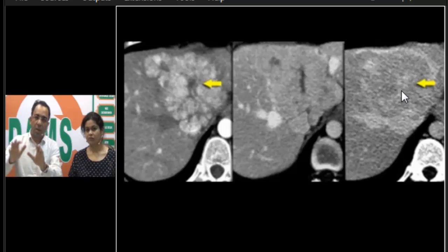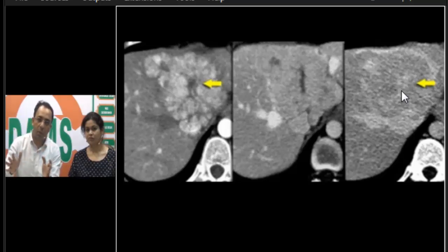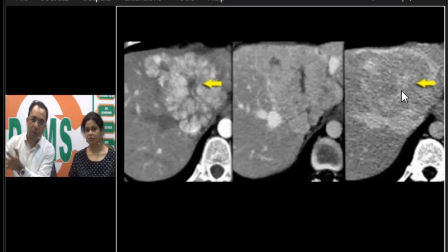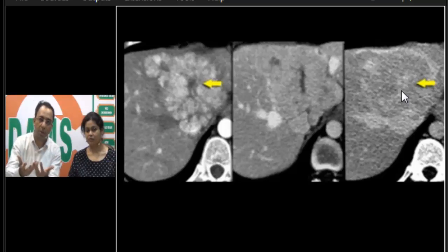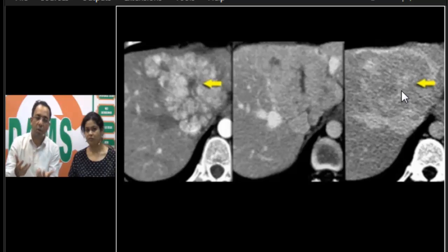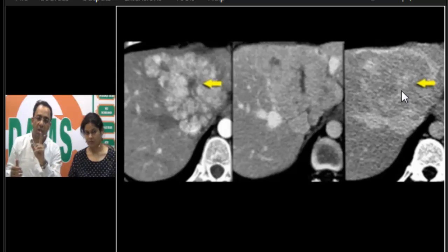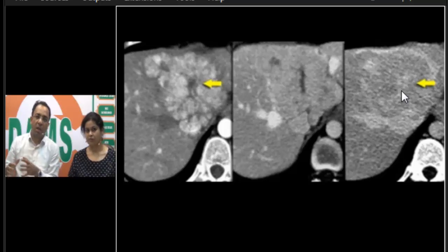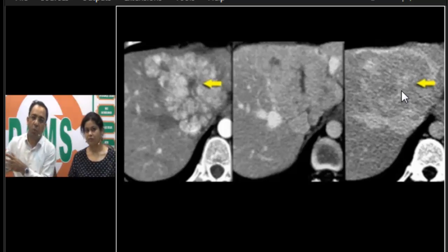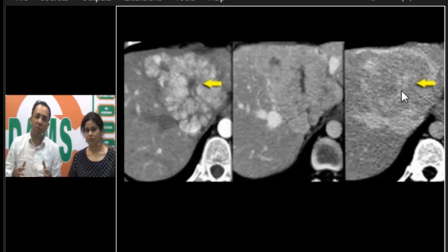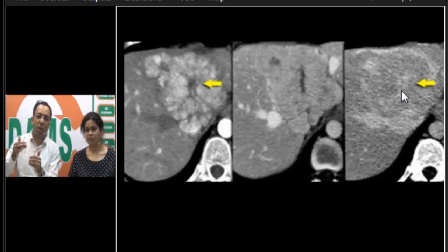Why is this not fibrolamellar HCC? The background liver is normal — but FL-HCC also occurs in non-cirrhotic patients and can also have a central scar. The key differentiating feature is calcification: fibrolamellar HCC usually has calcification. You may also see lymphadenopathy in FL-HCC, which helps differentiate it from FNH.